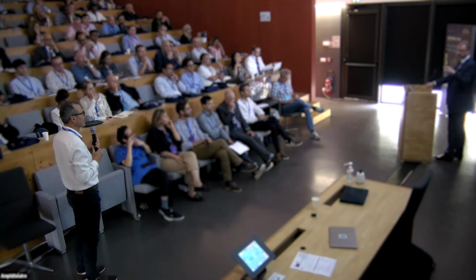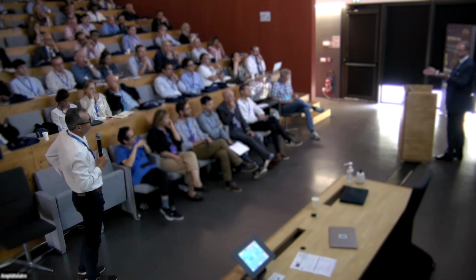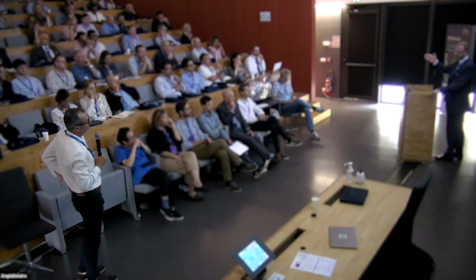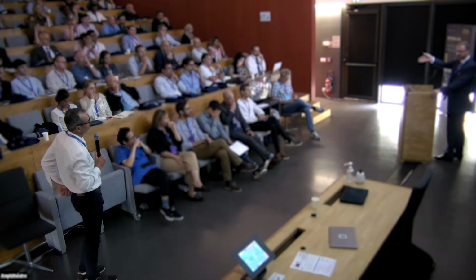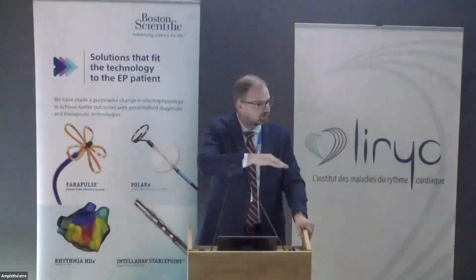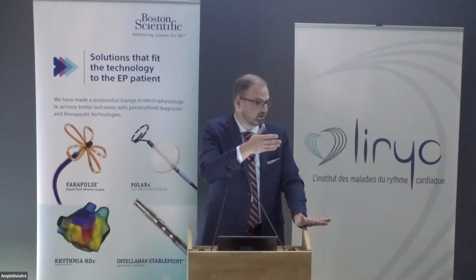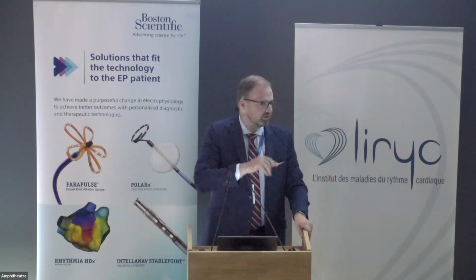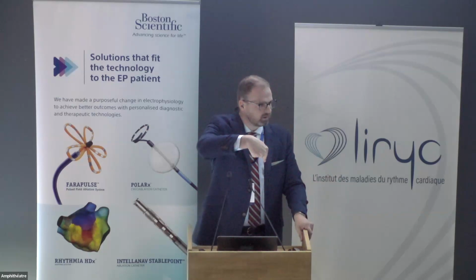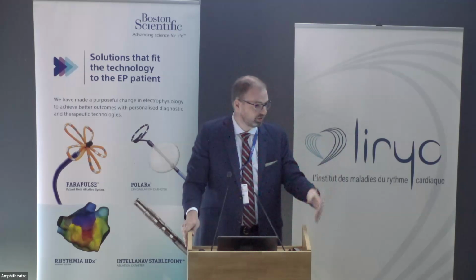I have a great slide on that tomorrow that I'll show you with lesions, but again, it depends on what you're trying to do. If you're just trying to ablate the CTI, maybe bipolar works well because it's kind of a linear lesion within the catheter, and you just go to the annulus and then pull back, and you're getting overlapping lesions. But this is oversimplified as well. Yes, sometimes we have to loop in and get the point. Absolutely, you have to come backward, 100%. Yes, so we kind of have both.